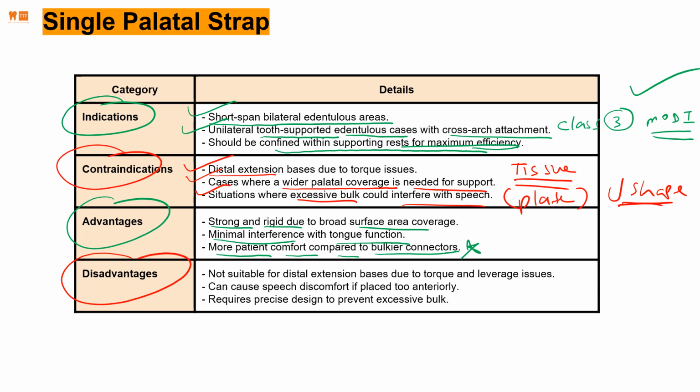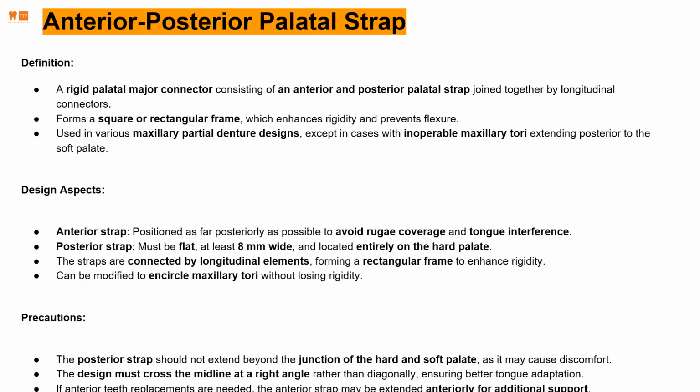Disadvantage: not suitable for distal extension as usual. There's torque, there's leverage issues, speech discomfort if it's too anterior, and it requires precise design to prevent bulk. Anterior and posterior palatal strap. So it's two palatal straps, right?